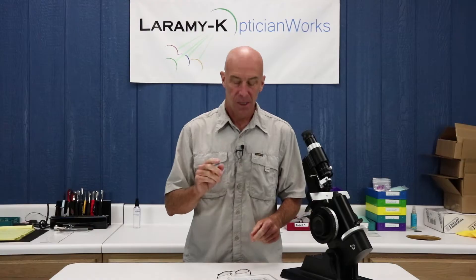Hello and welcome back to our ongoing series, Let's Learn How to Use the Lens Meter. Today is kit number four. Kit number four is a complete pair of mounted lined bifocals. We're going to use the lens meter to read both the distance and the near portion of those lenses.